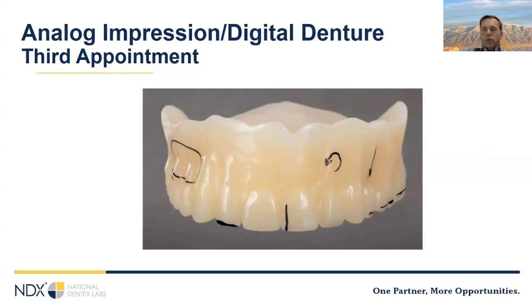So a few cool things about this. The first thing is that it fits exactly the same as the final denture. There's no block out. Other than digital, nothing will be the same on the final. So you can 100% evaluate the fit.